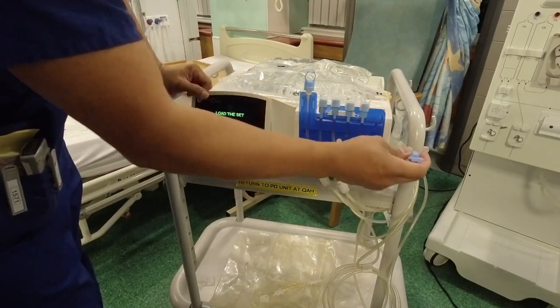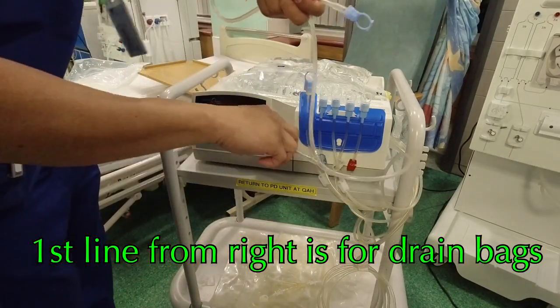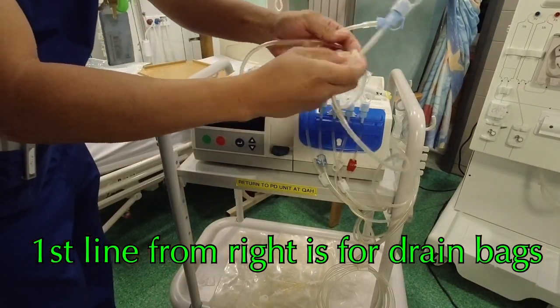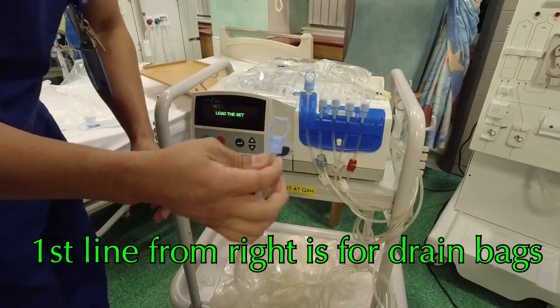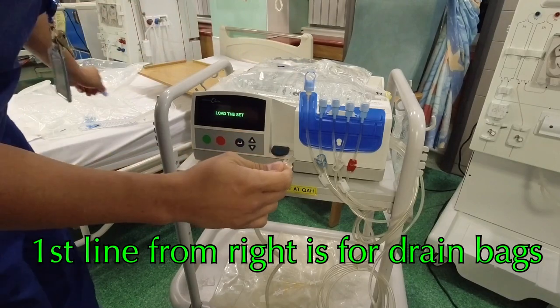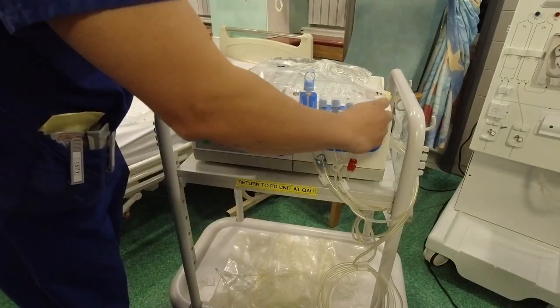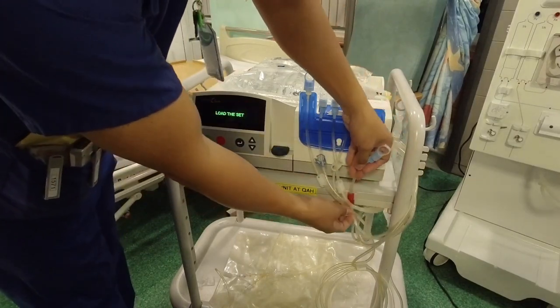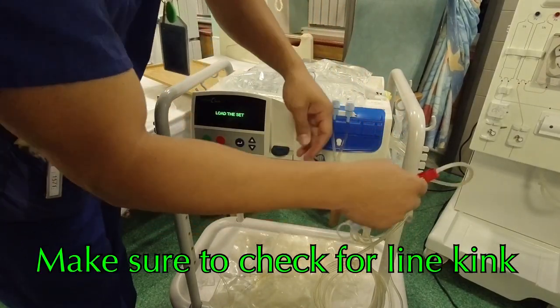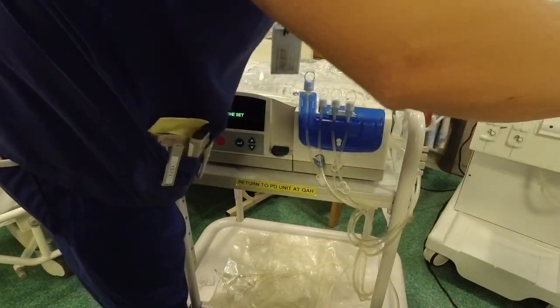Okay, so you start from here. So your right side, you have two lines there, that way you don't need, so you clamp that one. Okay, and this one goes to your drain. Yeah? Drain. That's the one. Okay. Just make sure you prevent any kink on the line. So make sure it's free.